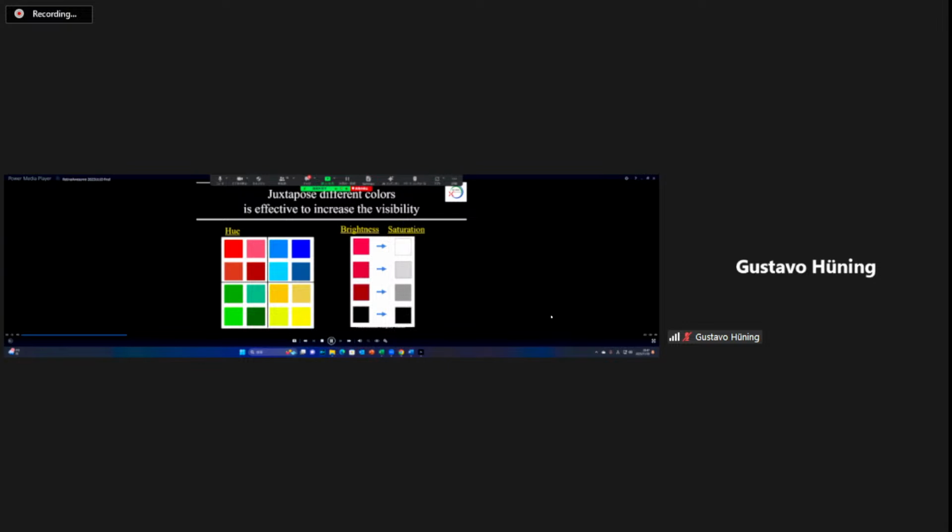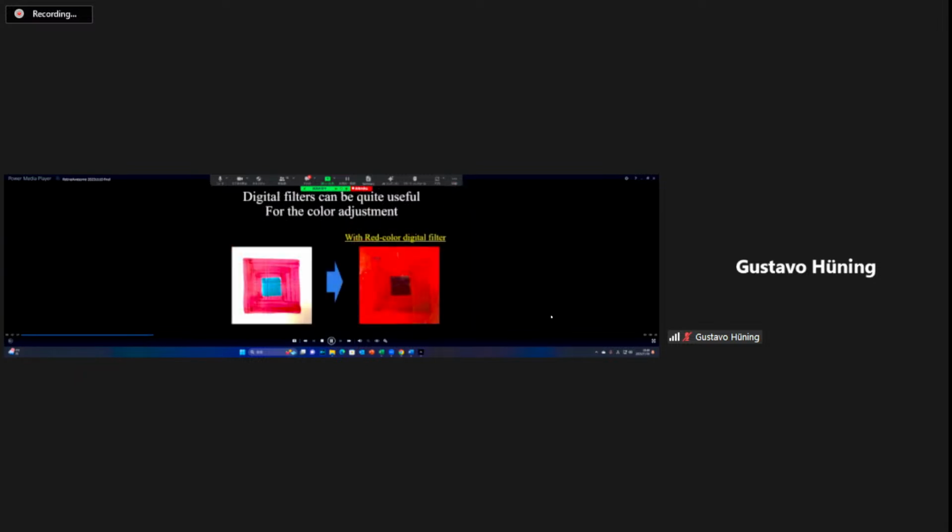Furthermore, reducing the saturation of colors in the image can help create a high contrast black and white image, further improving visibility. For example, if the original surgical view primarily consists of bright red and dark red, you can transform it into a white and nearly black image by decreasing the saturation. With heads-up surgery, you have the capability to adjust the three color properties mentioned above. Additionally, digital filters can be quite useful.